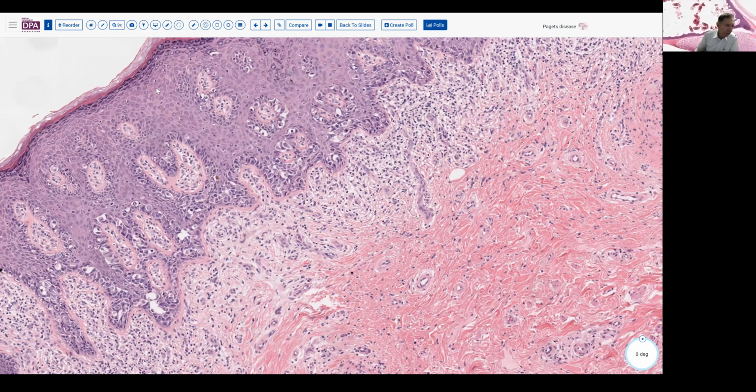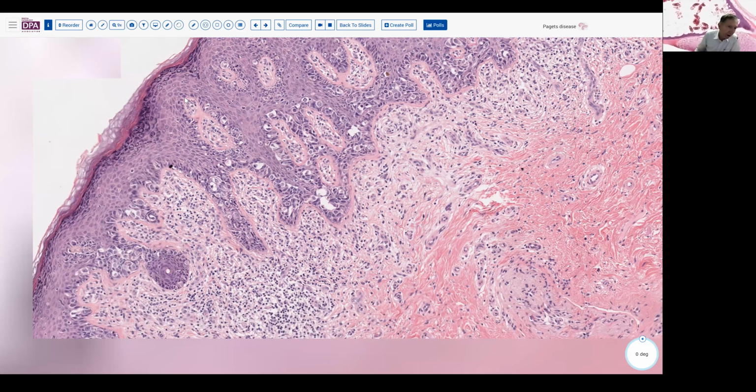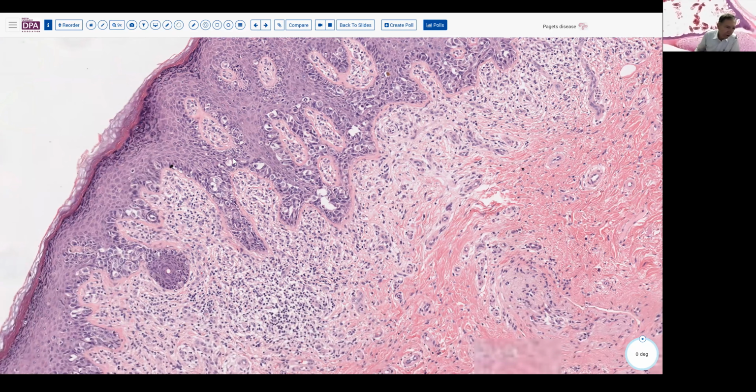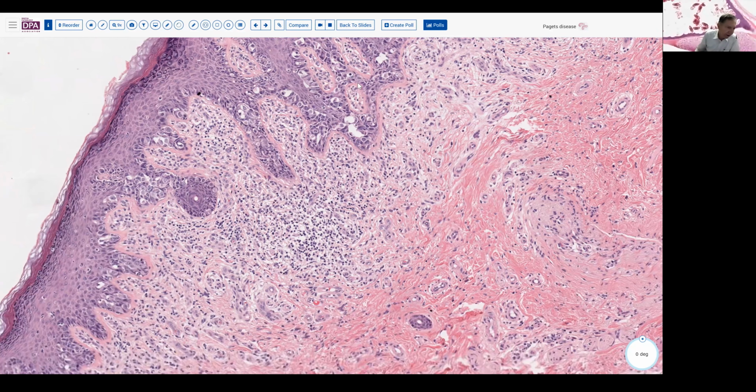So when I say that, we have the normal cells, the keratinocytes here, and then we have these other cells with variably clear to pale cytoplasm, some spacing, some nesting, and in several areas we would see upward migration of these cells above the dermal epidermal junction. So it's probably this process that is provoking this inflammatory reaction in the skin.